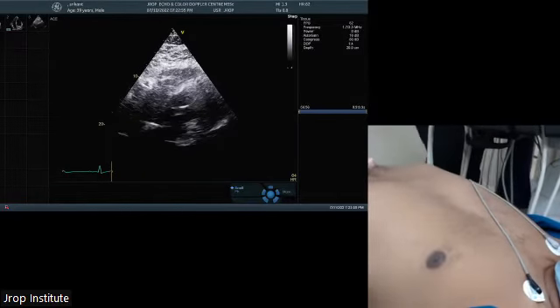Okay, anybody else? Dr. Rajshri Karat. Sir, my question is that in the right parasternal long axis, it is difficult to get a window in a normal patient, or is the window clear only in aortic stenosis patients for the right parasternal? Very true. Normally, you don't get this right parasternal window in normal subjects. This will be seen only when you have a significant, severe aortic stenosis.